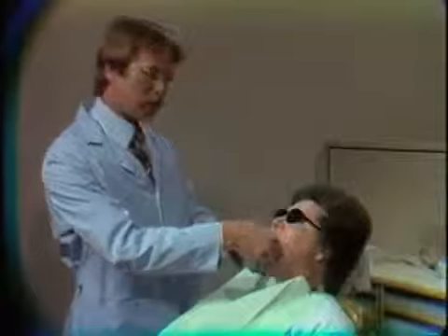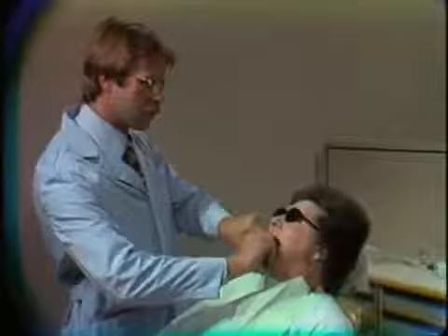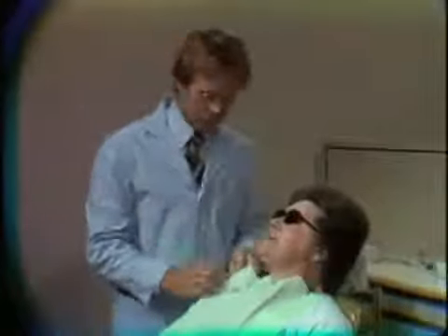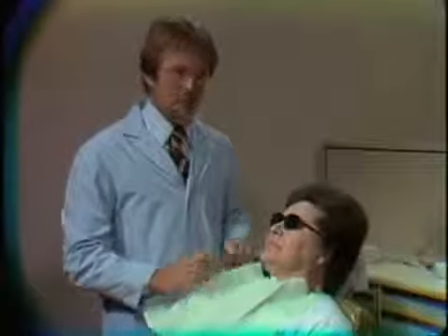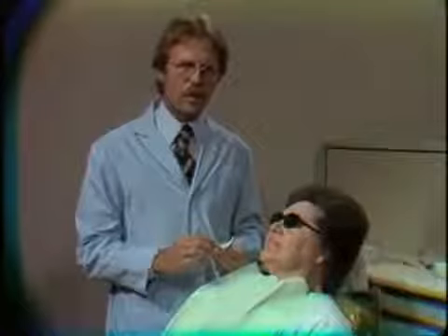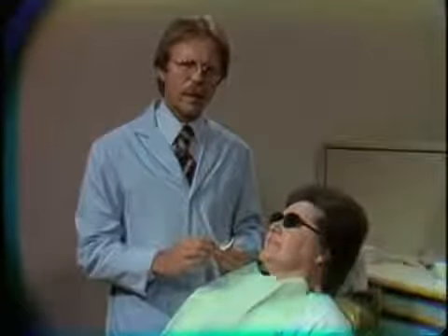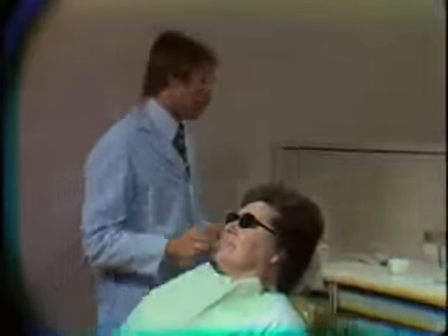Now we're going to take the partial denture from the patient, and the first thing we're going to do is to add an acrylic base or platform for our functionally generated path record. We're going to add the acrylic and then take it to the patient in the softened state and have the patient close into it.